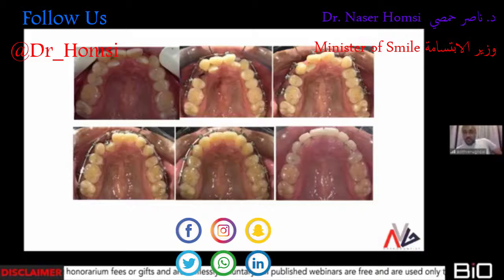What I'm trying to say is the factor of reproducibility. It does not depend on the appliance. Don't let anyone tell you that, oh, with this particular bracket, with Damon or with Genius or with any kind of self-ligating bracket, it's very easy to open up spaces, because that is a mistake. It's not a fact. It's a mistake, because you might get that kind of an expansion on one patient, but if you try the same on another patient, it may or may not work.